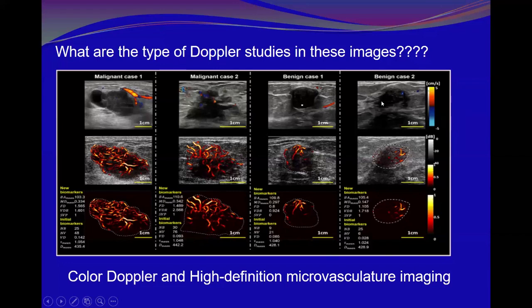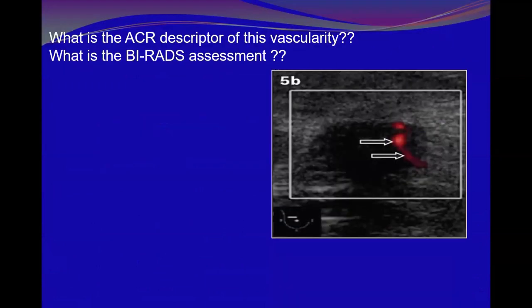And here, these are two examples of benign. Although it is not morphologically typical benign, as you know, sometimes there is overlap between the two, and these were fibroadenomas. Some new vascularity is seen in this fibroadenoma, but if you compare the new vascularity in benign and malignant, definitely there is no comparison. It is much more and much more aggressive in malignant rather than in benign lesions.